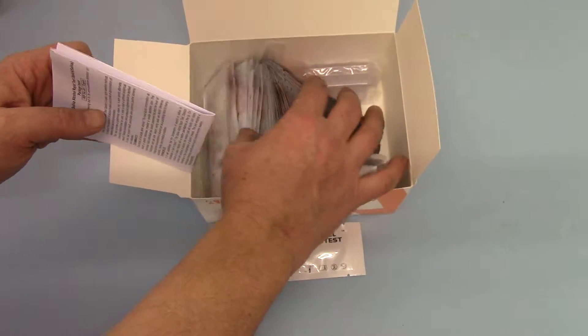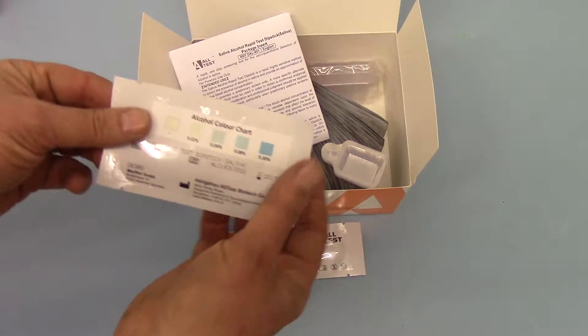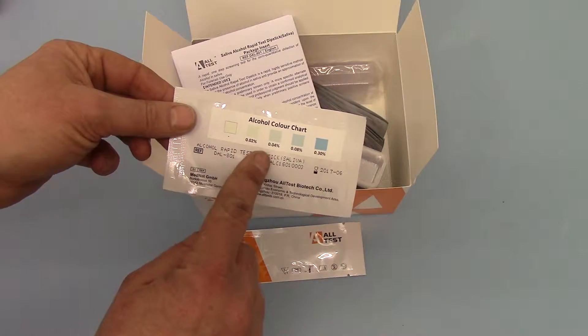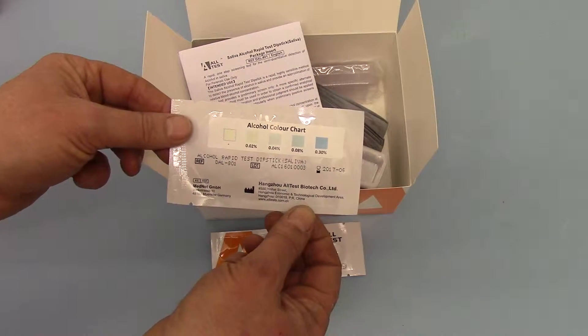Also included in the pack, on the reverse of the foil — if we show you the reverse here — is the colour chart showing the interpretation for the alcohol concentrations in blood equivalents.